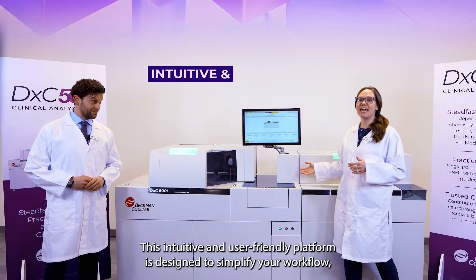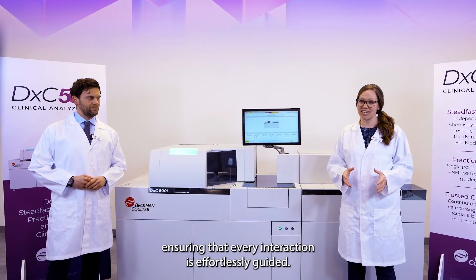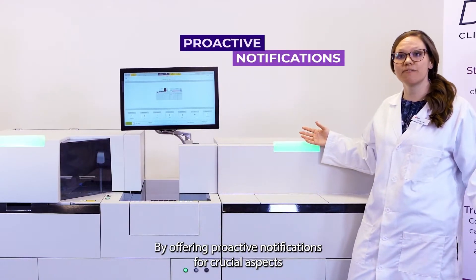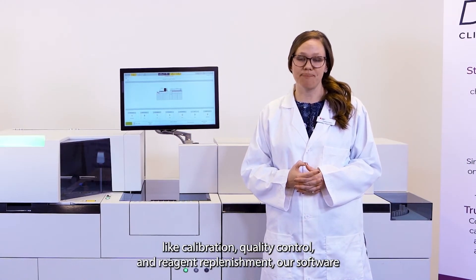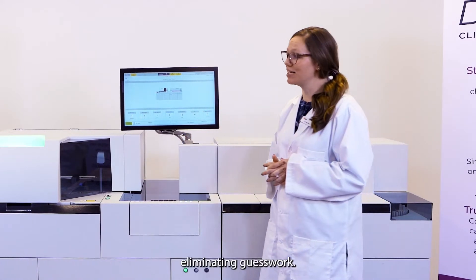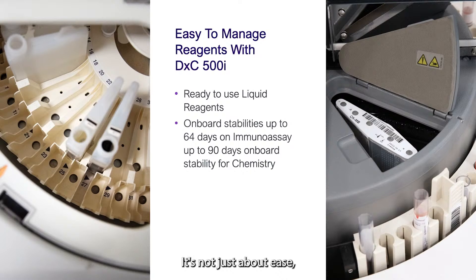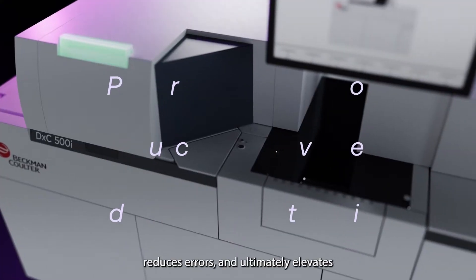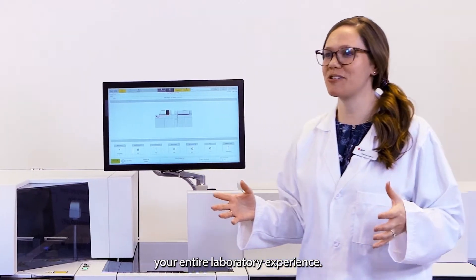This intuitive and user-friendly platform is designed to simplify your workflow, ensuring that every interaction is effortlessly guided by offering proactive notifications for crucial aspects like calibration, quality control, and reagent replenishment. Our software user interface becomes your proactive companion, eliminating guesswork. It's not just about ease — it's about a practical and simplified approach that enhances precision, reduces errors, and ultimately elevates your entire laboratory experience.